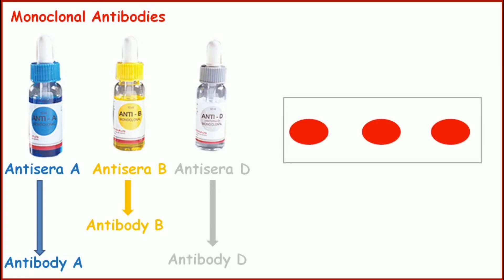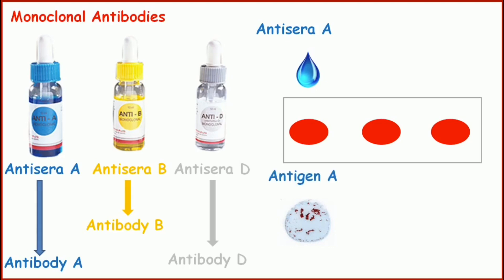Let's take three drops of blood separately on a slide. We will add antisera A in the first drop of blood and mix well. If after mixing we can see agglutination, then antibody A which is in the antisera A reagent has interacted with antigen A on the red cells, showing visible agglutination or clumping. So we can say antigen A is present in the blood. Now for the second drop of blood, we add antisera B and mix well. If we see agglutination, antibody B has interacted with antigen B, confirming antigen B is present.